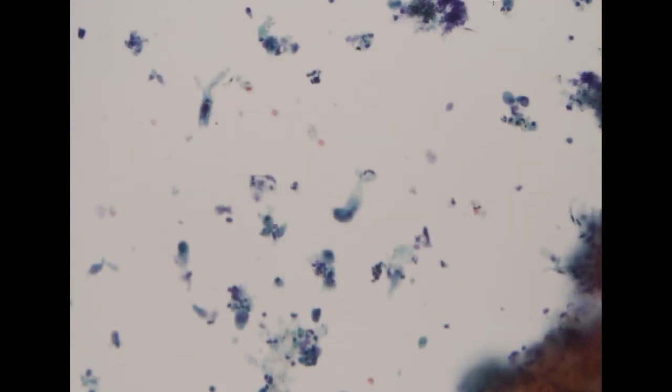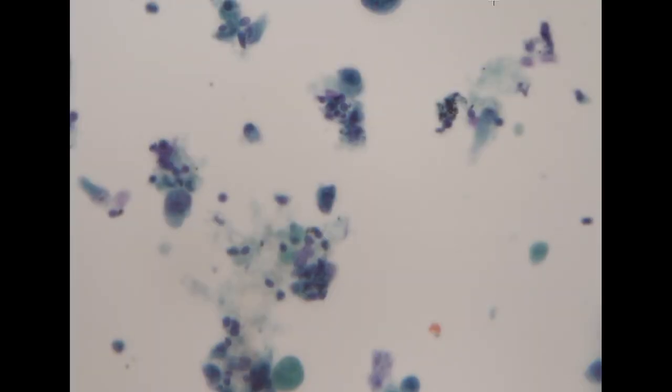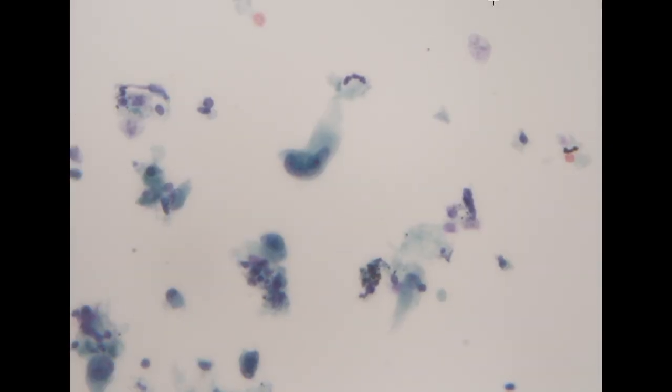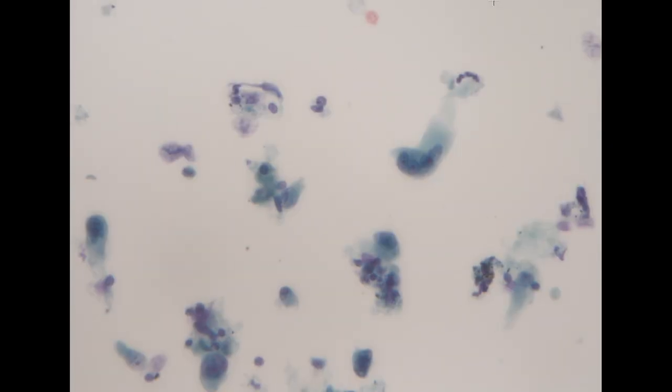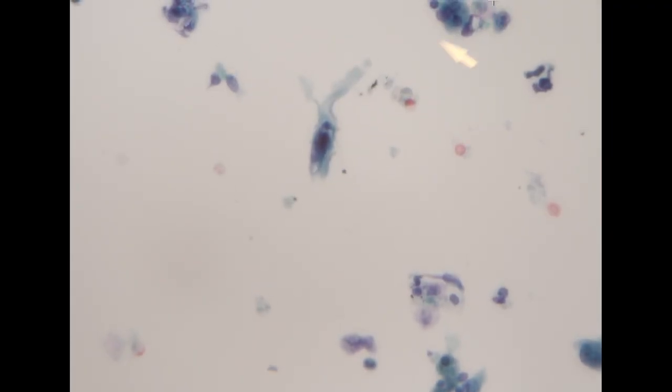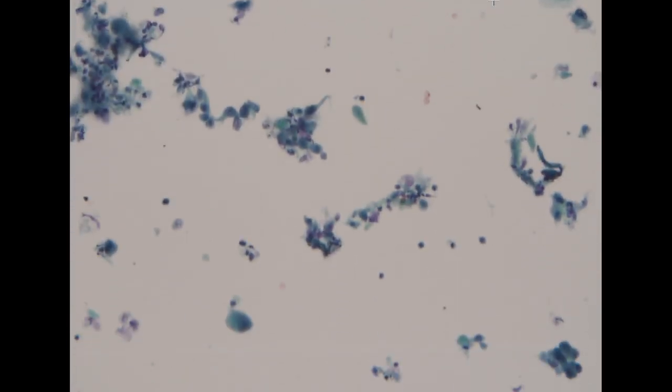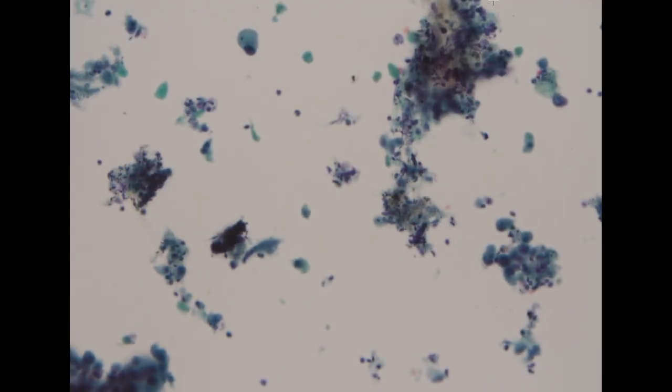So this type of feature is already exceeding the usual pattern of adenocarcinoma that we would see in a pancreas biopsy. And with these, a lot of necrosis and these highly atypical cells, some even forming these like spindle-shaped large spindle cells, we would be thinking about, could it be an undifferentiated carcinoma of the pancreas, right?